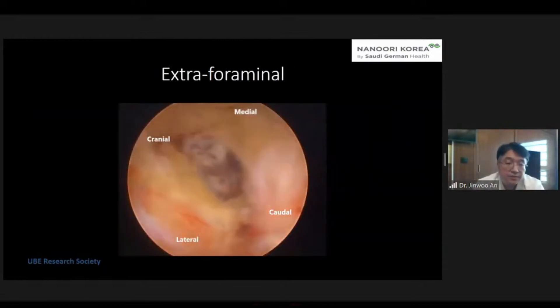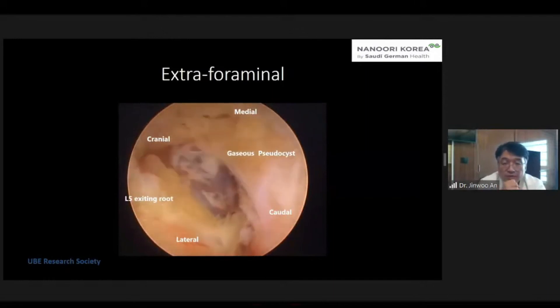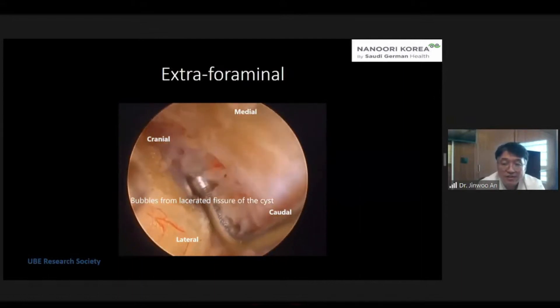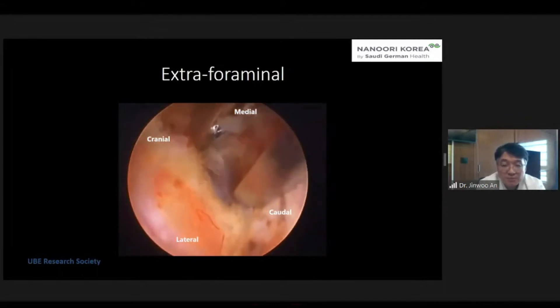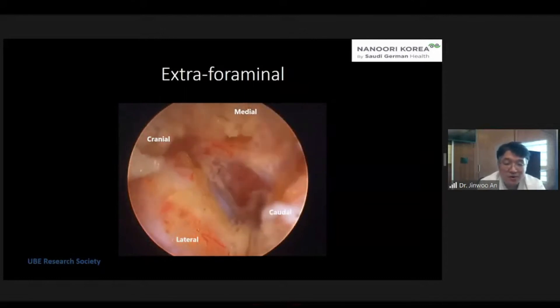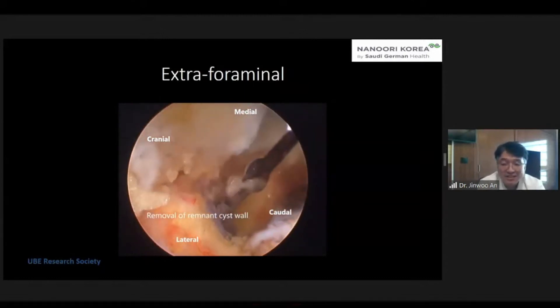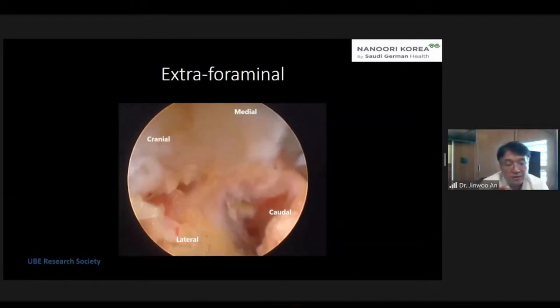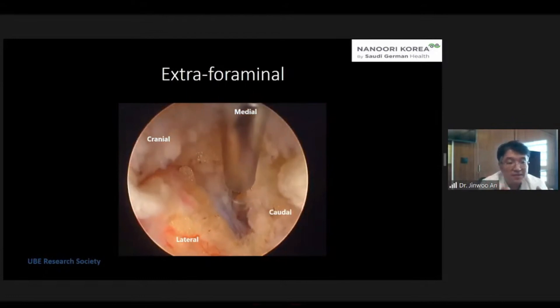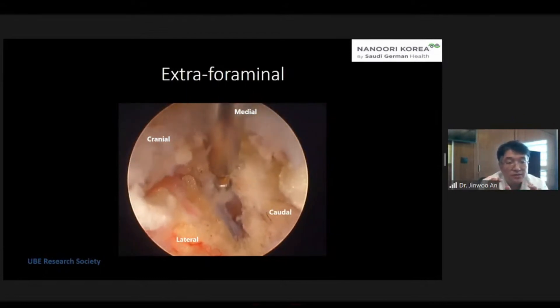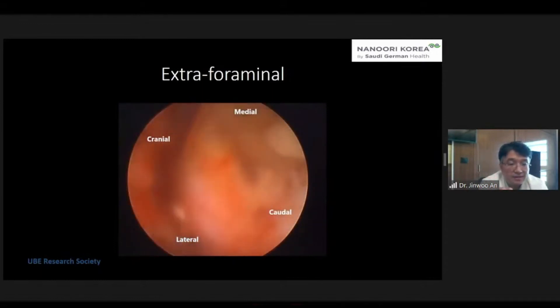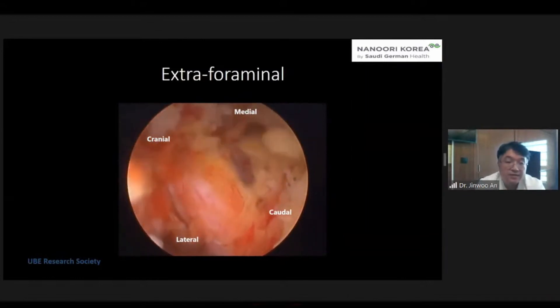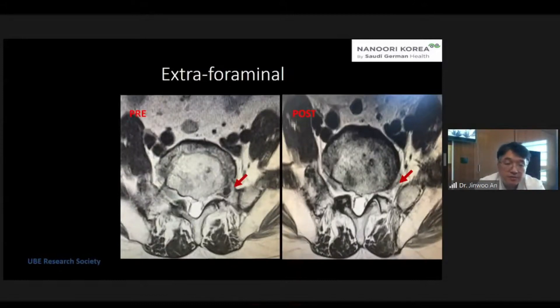This is the video clip. I did a paraspinal approach. You can see, beside the L5 root, I found the air-containing cyst system — you can see the air bubbles. Imagine if you do this surgery with tubular or open surgery — you cannot see this beautiful, very clean view. The difference between microscope and endoscope is that after surgery we can confirm the disc is completely removed, making finishing the surgery very easy. We can also check the decompressed nerve root. After surgery, we can see the removed cyst in the left side extra-foraminal area.